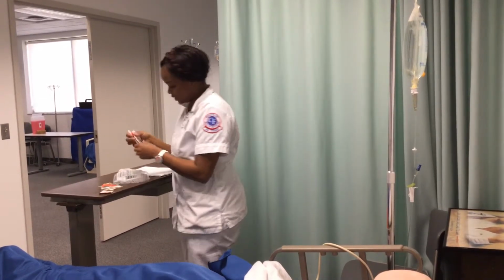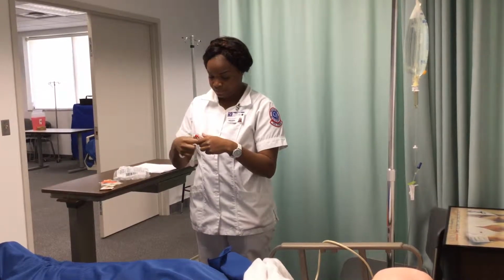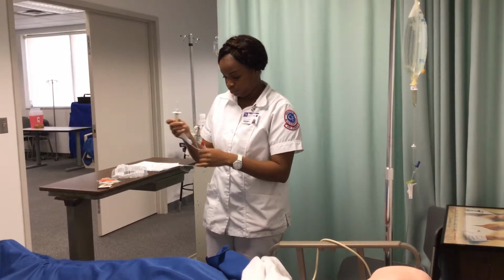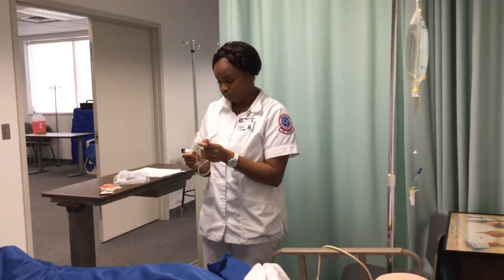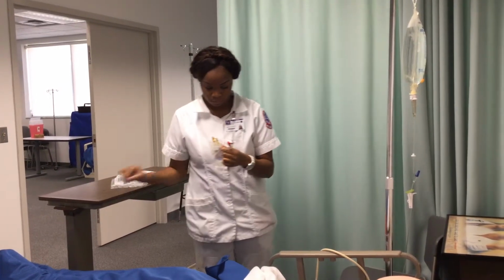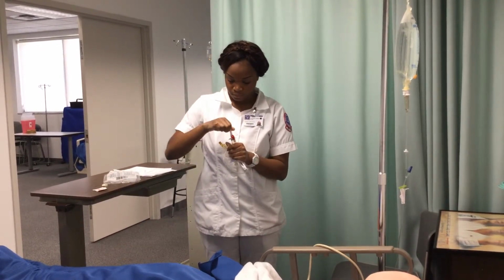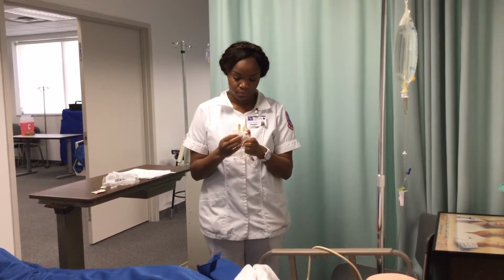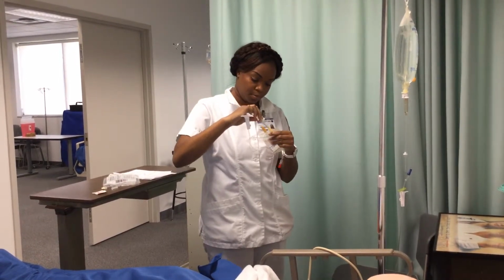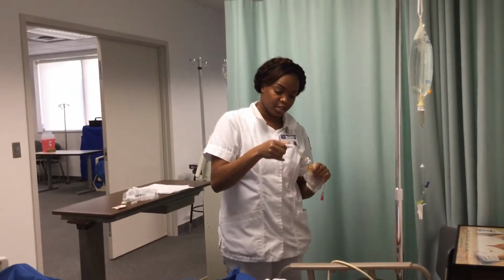I have all of my supplies here. In the bag, making sure that this is closed.